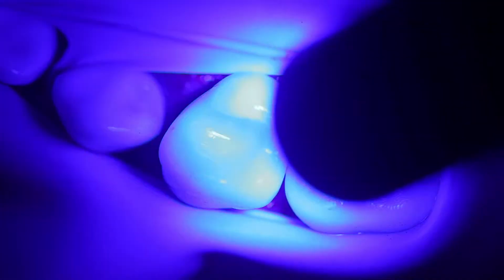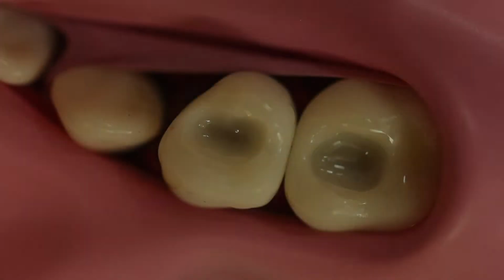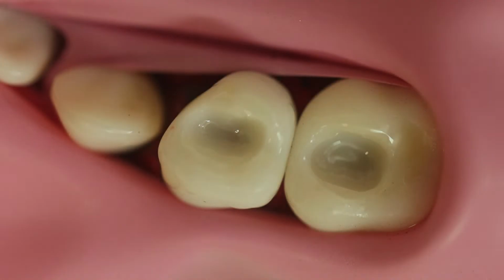We are using a 3M Elipar light cure, which has a good intensity, and the depth of cure is really good. Once done, you can check your bonding agent.